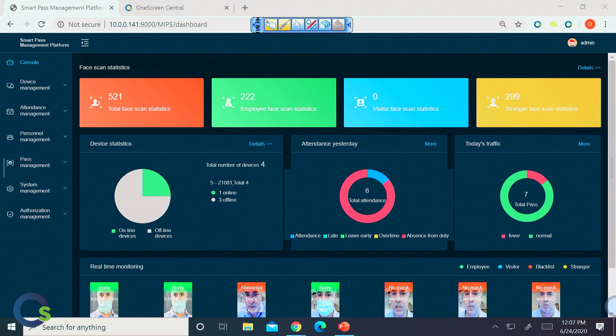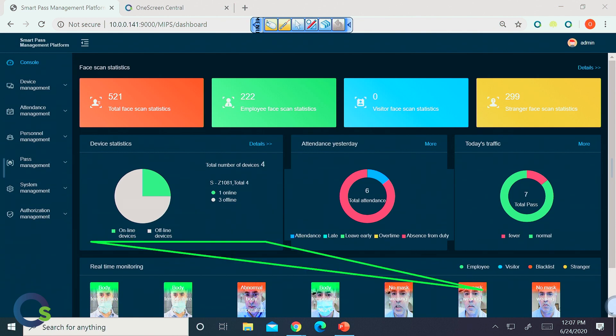Jumping right into our OneScreen GoSafe data and device management platform — this is where you have the ability from any device on your network to access all the data of the devices as well as the devices themselves. We're in the data console, and this is where you have the ability to see all the face scans and statistics — total face scans broken out into employee, visitor, and stranger. We also have an area for attendance and the day's traffic, showing how many people have normal temperatures or a fever. Down at the very bottom, we have real-time monitoring of all the images coming directly into the screen.